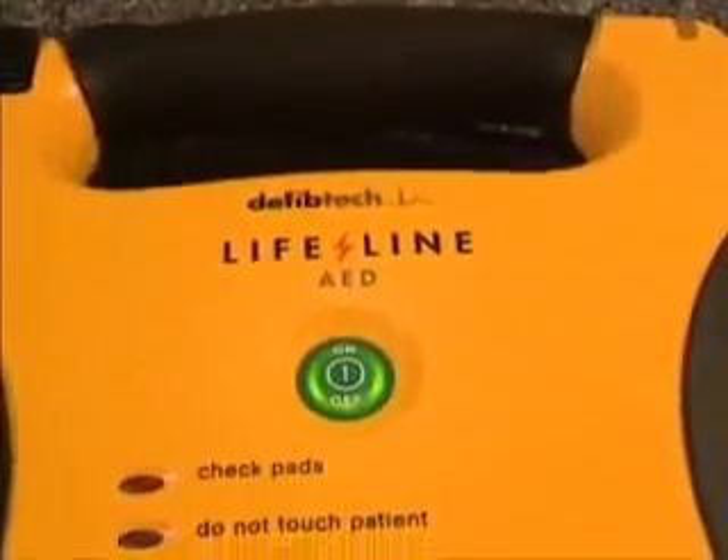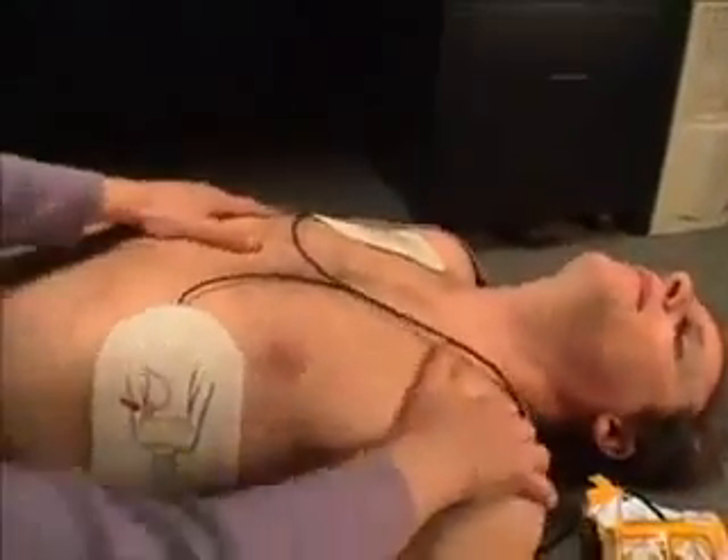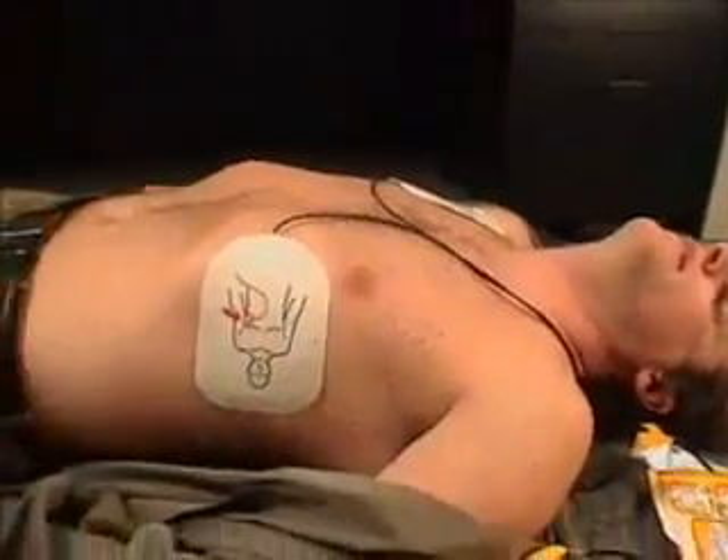Stop motion. The unit will not analyze the victim's heart rhythm if it detects the victim is being moved. Stop motion and do not touch the victim if so instructed.